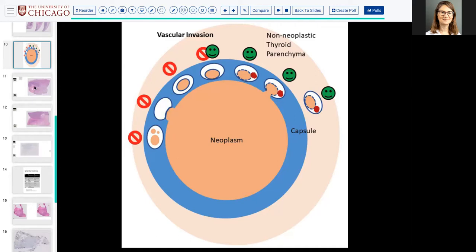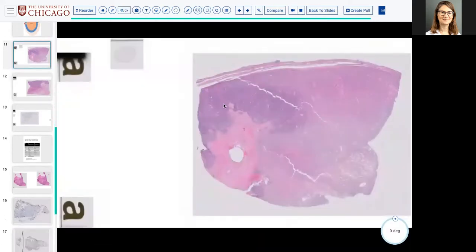Once you have an angioinvasive carcinoma, what's the treatment? Same or different than minimally? The whole, exactly. So these patients will often get completion with radioactive iodine ablation, because once you're in a blood vessel, you have a significantly increased risk for visceral, pulmonary, bone, brain metastases. So yeah, these patients get the whole. Okay, next.